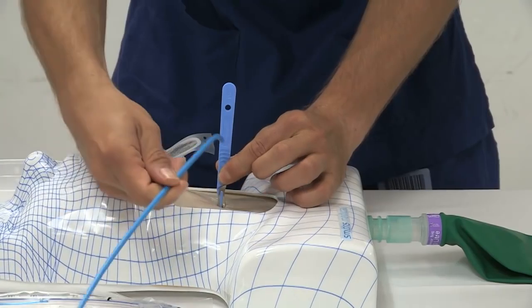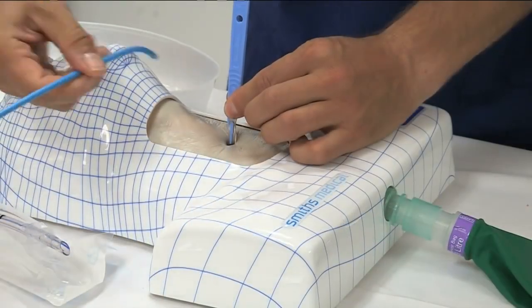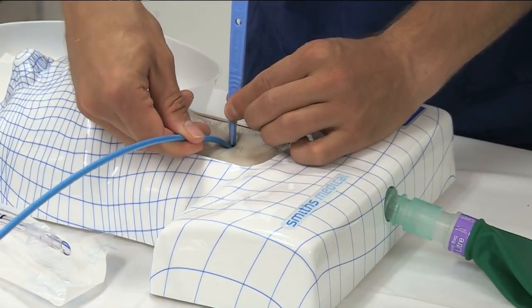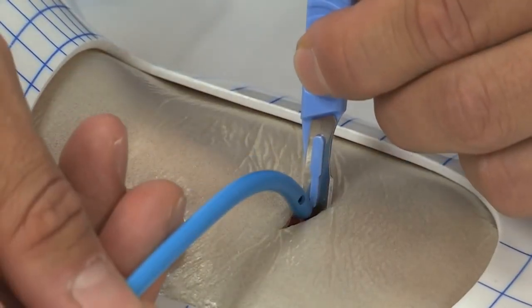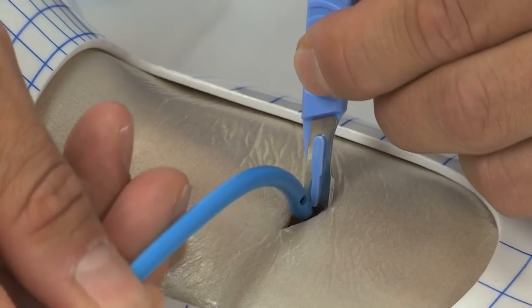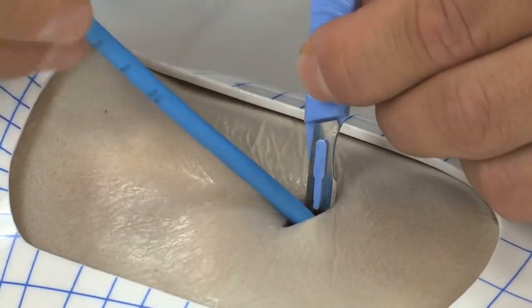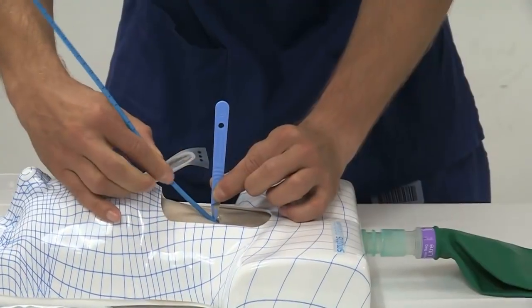The dominant hand now holds the bougie parallel to the floor, pointing away from the anesthetist. The tip of the bougie is then inserted into the airway whilst maintaining contact with the scalpel blade and using the blade as a guide into the opening of the airway. It is usual to feel a pop as the bougie enters the airway. The bougie then needs to be rotated and aligned with the airway before it is advanced into the trachea.